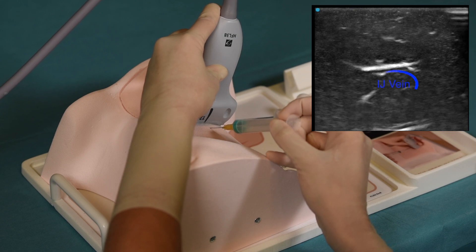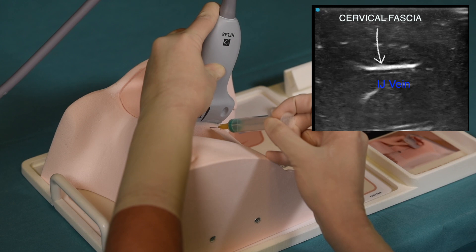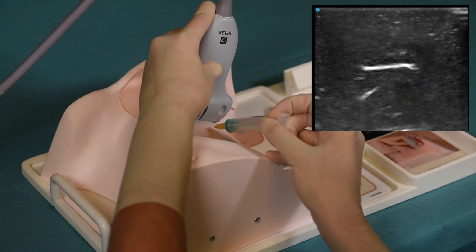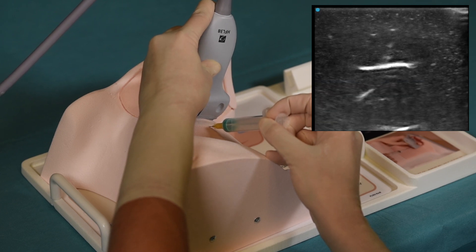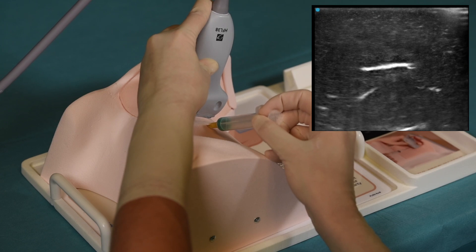In this particular example, we see the anatomical image in which we can recognize the internal jugular vein and the cervical fascia on top of it. We are using a cross-sectional approach and the needle is placed out of plane to reach the internal jugular vein. The needle tip is seen entering the vein, and as it advances, the ultrasound transducer is gradually moved more caudally.